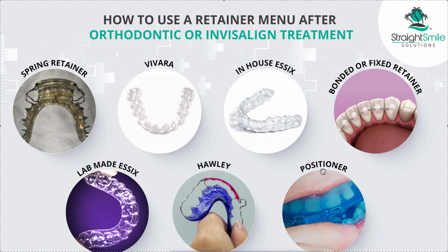TP Orthodontics is a lab in South Bend, Indiana. They've been around 50, 60, 70 years, since definitely the 50s. They are the people. They can make them in colors. There's all kinds of customizations. It's really, really cool, and they're still doing it. Takes about 6 to 8 weeks, I've heard, for one of these to come in.